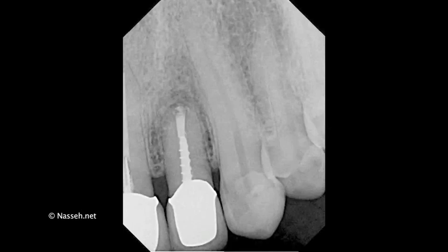Of course, this tooth has healed perfectly fine and the patient is asymptomatic. But since then, I have learned that after placement of the putty into the root repair material, it's best to simply clean up the little bit of excess with a micro brush.